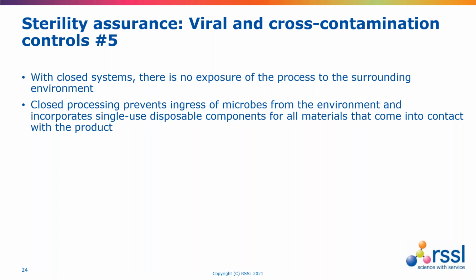So often this necessitates the frequent application of a sporicidal agent, and if there were risks of prions, for example, and any equipment needs to be reused, such as a stainless steel component, then the CDC guidance for prion inactivation would necessitate the use of 1 molar sodium hydroxide, followed by autoclaving at 134 degrees Celsius for 30 minutes. So you get an idea of that level of control that's required if there was a prion risk.